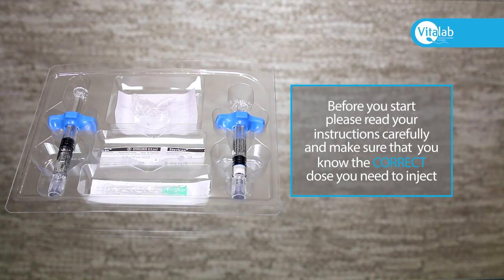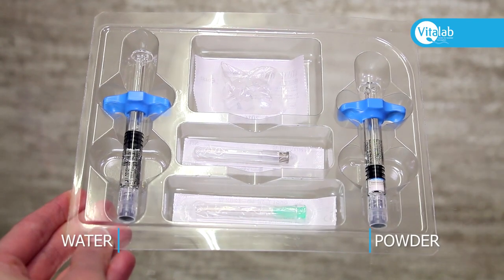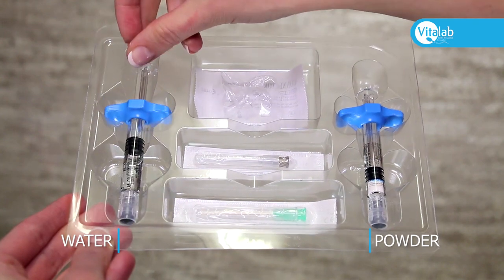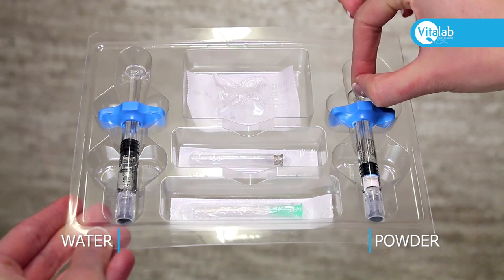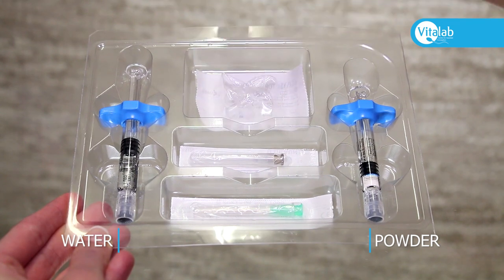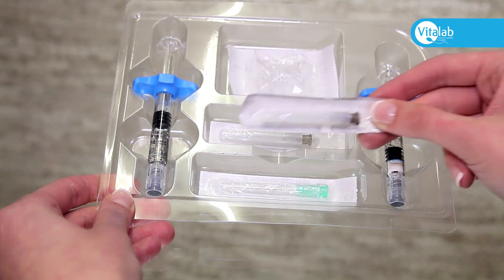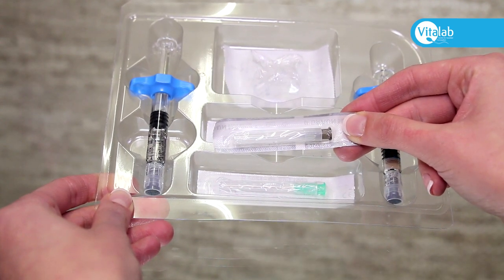Before you start, please read your instructions carefully and make sure that you know the correct dose that you need to inject. Opening the package, you will see two syringes — one with water and one with powder — the connector, and two needles. An alternative needle will be purchased or given to you to use in place of the two needles in the package.